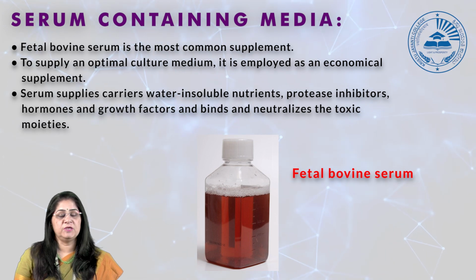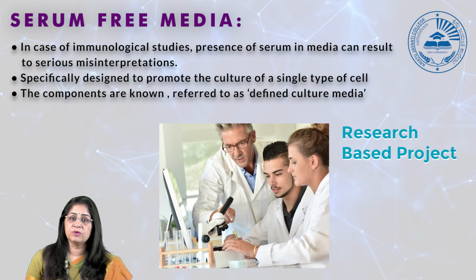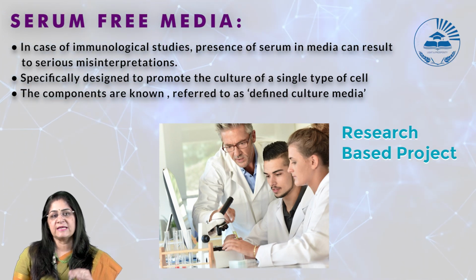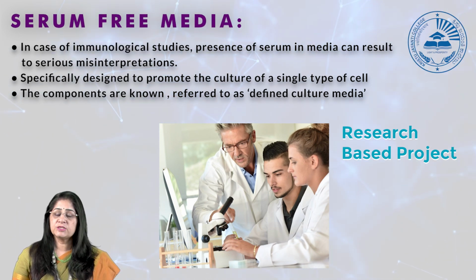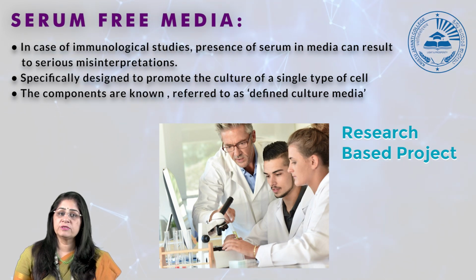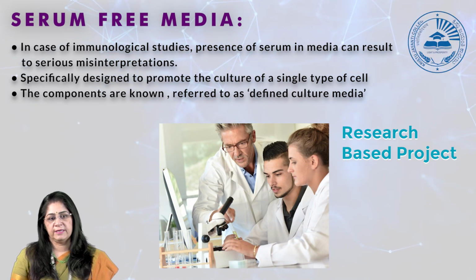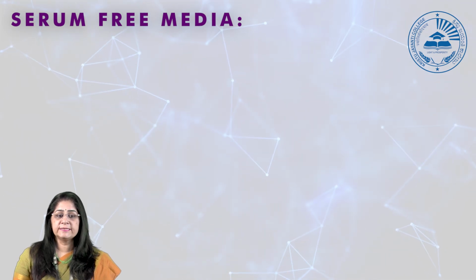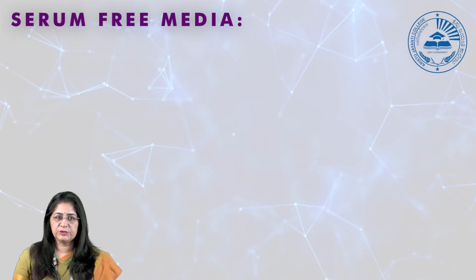Serum free media is being utilized nowadays, because if your research work is based on immunological markers and things like that, it is better not to use a serum, because that will interfere with your studies. So in such cases, you use serum-free media. Presence of serum in media can result in serious misinterpretation of your results. So depending upon what you are studying, accordingly you can use either serum-containing media or serum-free media. They are specifically designed to promote the culture of a single type of cell, and the components are referred to as a defined culture media.